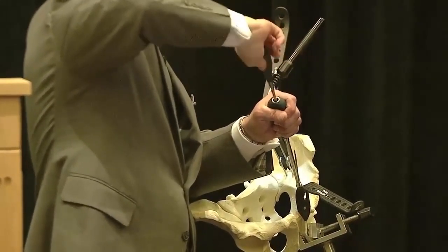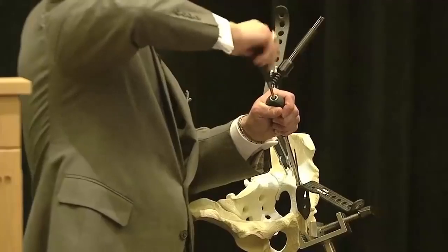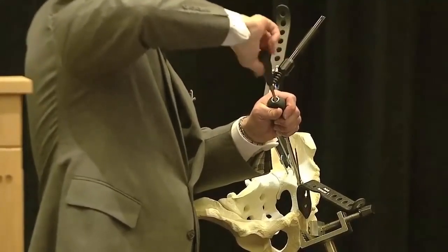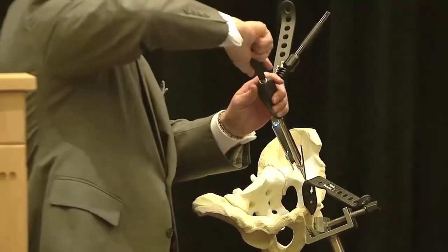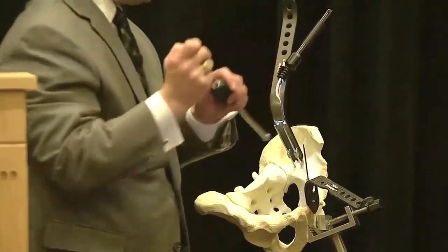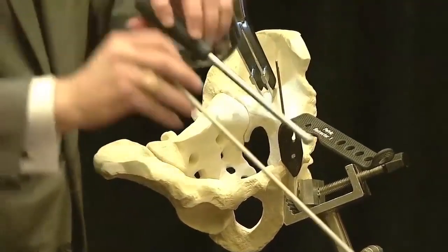And sometimes it's a small space. Getting a ball spike in, a drill, and the screwdriver is tight. This allows you to do it with less hands in a small space. We don't drop the screws or the washers in the wound, which happened all the time before. And secondly, this sleeve protects the soft tissues around us, the bladder and the vessels. You can see now that washer and screw went in, and it's completely reduced without doing anything but one hand holding, one hand drilling and screwing. And that's a really nice concept for us.